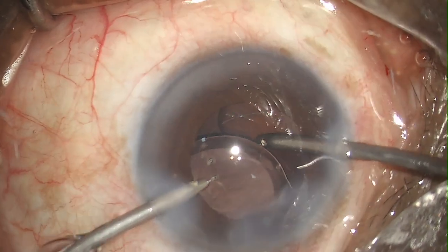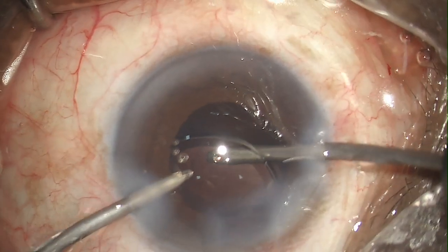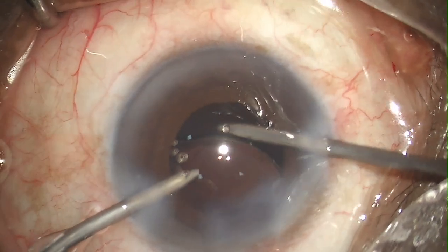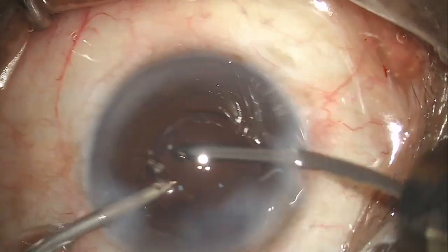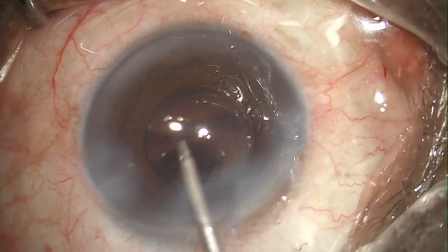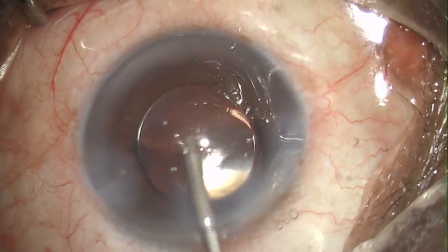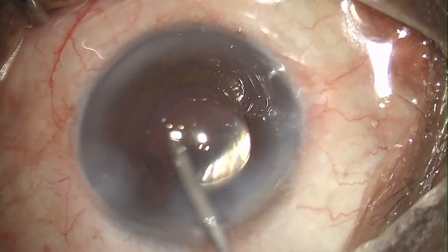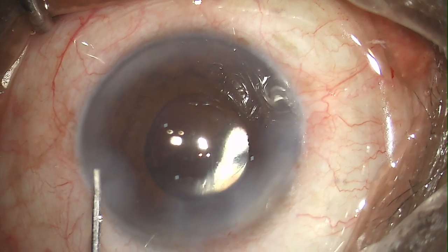I always try to get the viscoelastic removed from behind the lens, and always try to remove as much viscoelastic as possible. I have a technique of removing the viscoelastic from the anterior chamber with the irrigation probe itself — this helps in removing viscoelastic that is stuck in the angle easily.